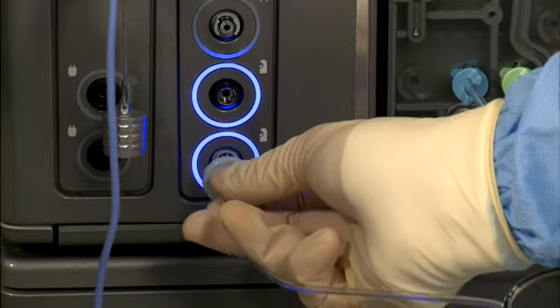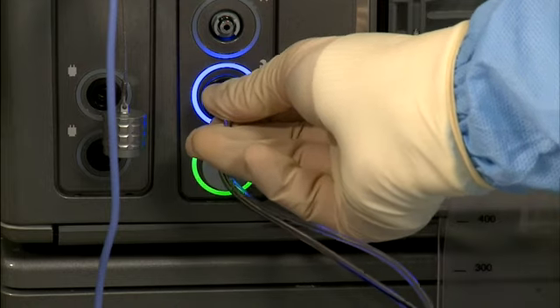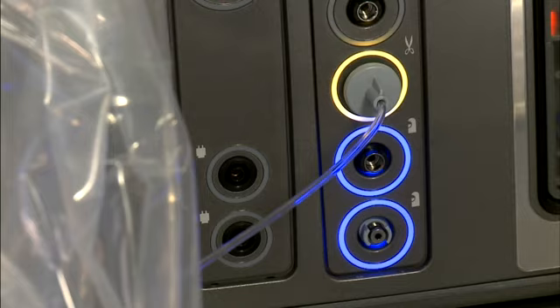Connect the gray and black pneumatic drive lines to the console — gray to gray, black to black. The flange on the connector acts as a sterile barrier, so this task can be performed by the sterile scrub nurse. The radio frequency identification rings will illuminate green when attached. If the connector illuminates amber, this indicates that the handpiece has been connected to the wrong port.